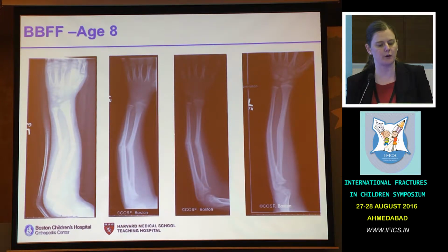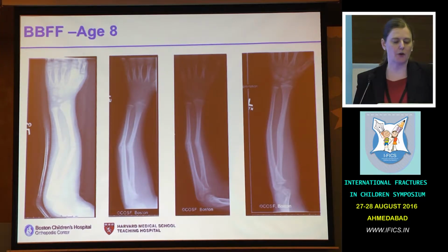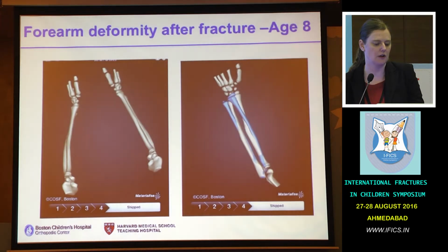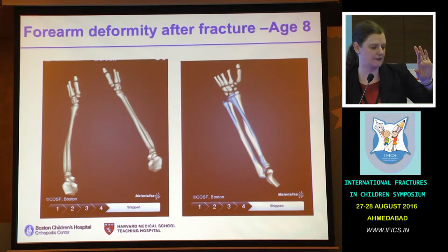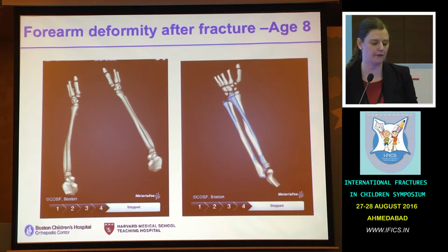However, if you look at the deformity, it's a fairly mild deformity. His mum also hated the bump that he had on his ulna, on the ulnar border, because it was rounded. So I felt that this was a perfect indication for trying to use something that enabled increased precision in the correction. This particular technology uses bilateral forearm CTs with a 3D reconstruction, transposing the right normal arm as a mirror image to make it the left arm. And then you've got the blue and beige images there, and you can see the deformity.